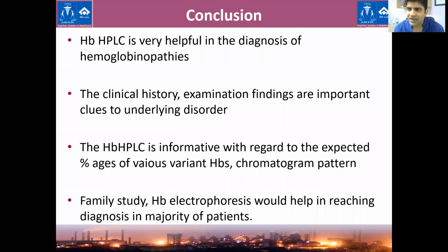So if you could summarize when you would require electrophoresis after HPLC has been done, and what the clues on HPLC are that make you run electrophoresis on the sample. And the second, which is linked to that, is alkaline and acidic pH electrophoresis: the differences between the two, and how they help us in different scenarios. So these are the two questions for the time being.